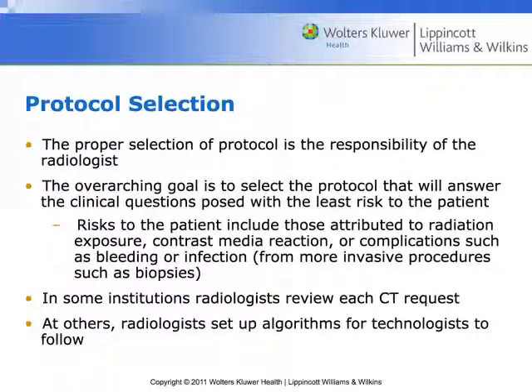I worked with a very large radiologist group in Austin, and they had a radiologist who was dedicated to prescribing protocols for all their different CT scanners. They had everything from a two-row GE CT scanner to a 128-row Siemens, and each of those machines needed particular protocols written for it. That radiologist's job was just to tweak protocols all day long. We all hated that person because they were constantly sending us protocol updates in a PDF file. We'd comb through it and see, oh my gosh, they changed this one again, and we'd have to go back and change that in the CT scanner.